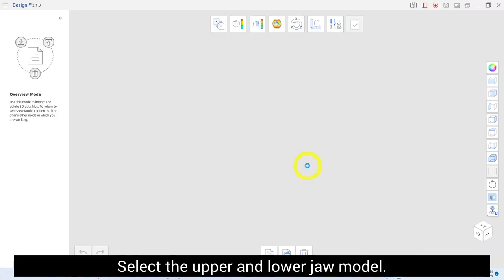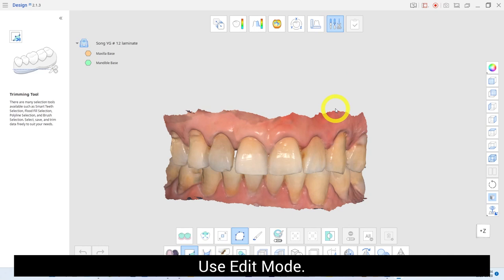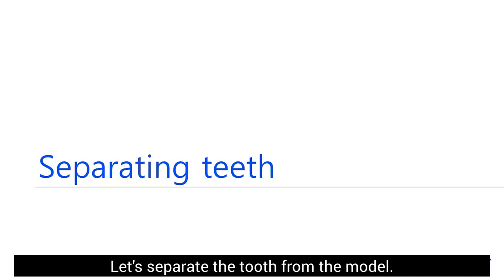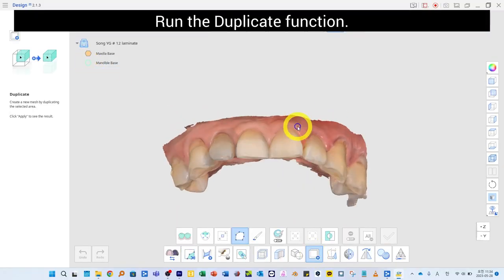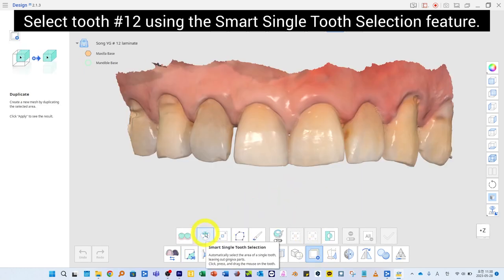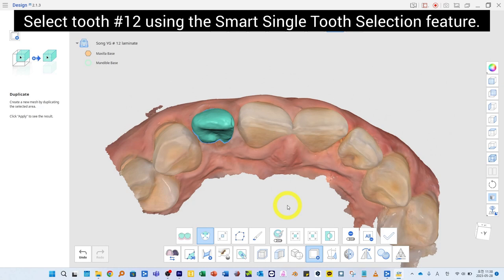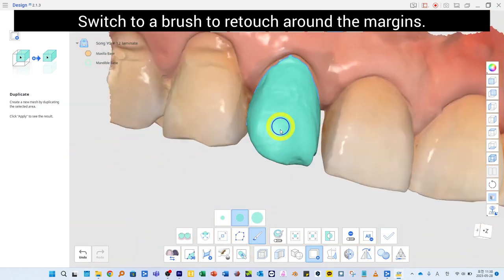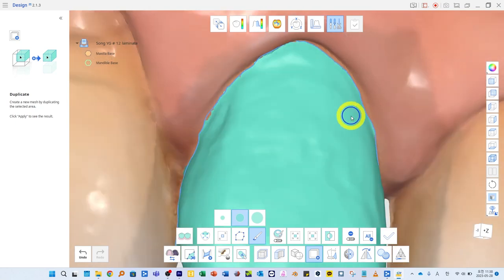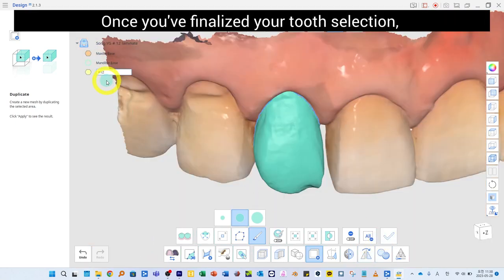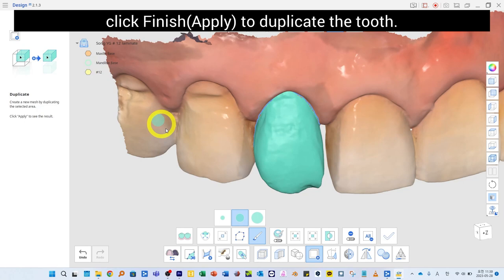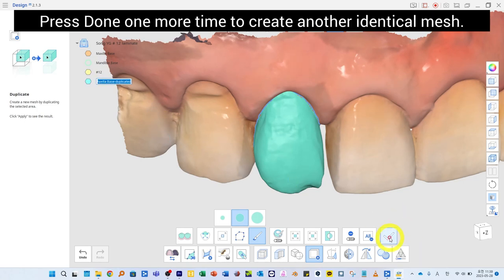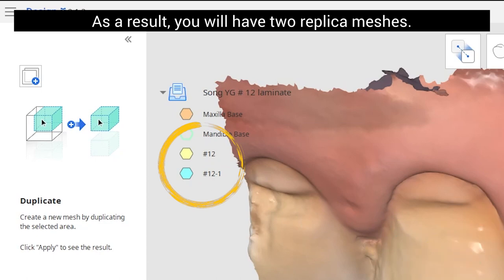Select the upper and lower jaw model. Use Edit mode to separate the tooth from the model. Run the Duplicate function and select tooth number 12 using the Smart Single Tooth Selection feature. Switch to a brush to refine around the margin. Once you've finalized your tooth selection, click Finish to duplicate the tooth. Press Done one more time to create another identical mesh. As a result, you will have two replica meshes.